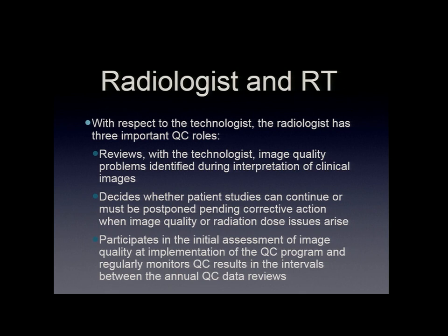So there is a responsibility on the radiologist to communicate with the technologists as well as the medical physicists. And then when you evaluate these artifacts or problems they're seeing, do we need to continue acquiring clinical images, or do we need to have corrective action before we proceed? So that discussion needs to happen.